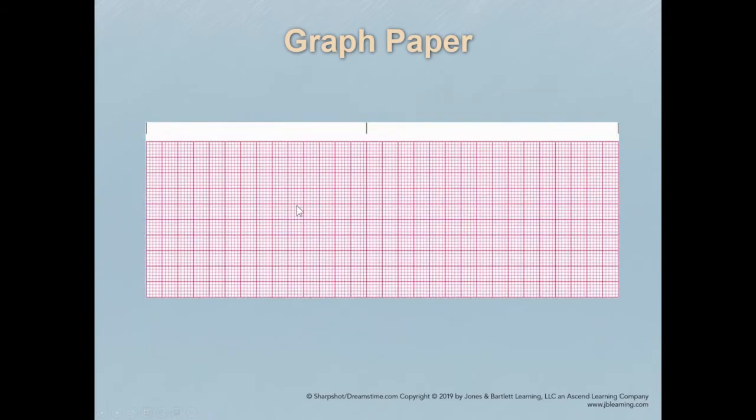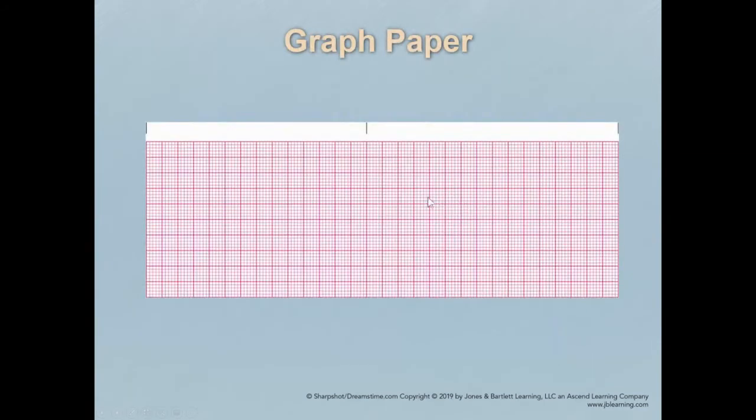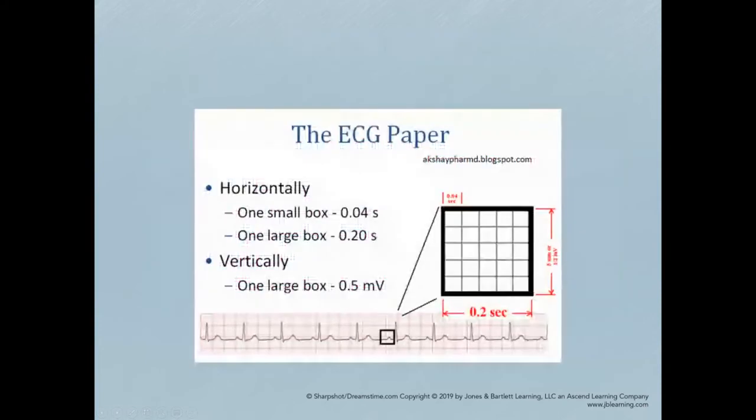And they come together to create a grid. Each one of these grids is a 5 by 5 square, which means it is 5 millimeters across and 5 millimeters high. Over here, the same, 5 millimeters across, 5 millimeters high. And when we break that down, what we're actually looking at is one of these individual boxes in the next slide, one of those 5 by 5 boxes.